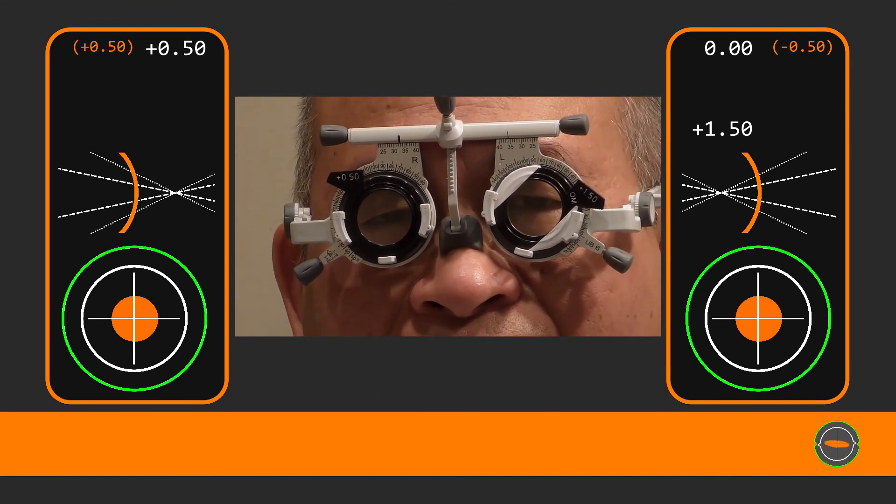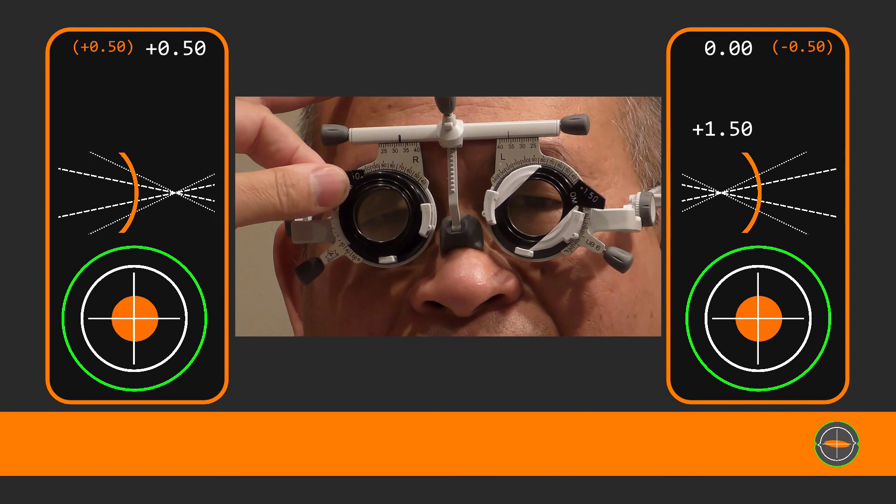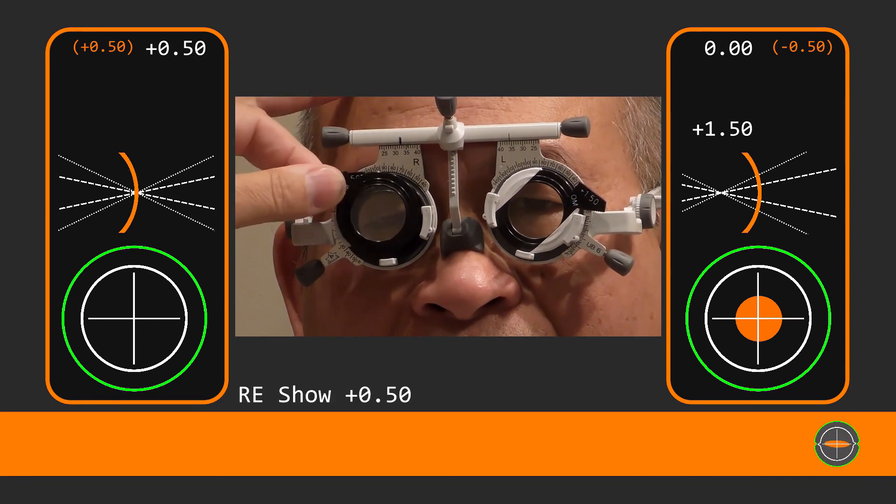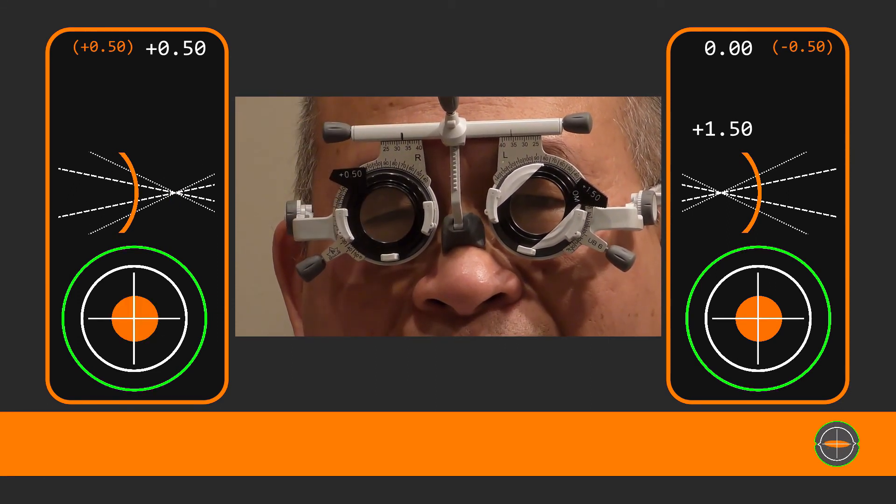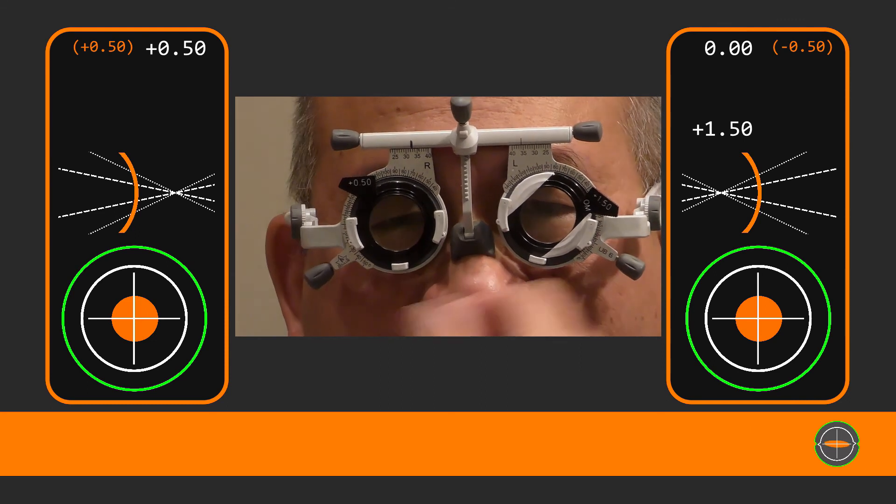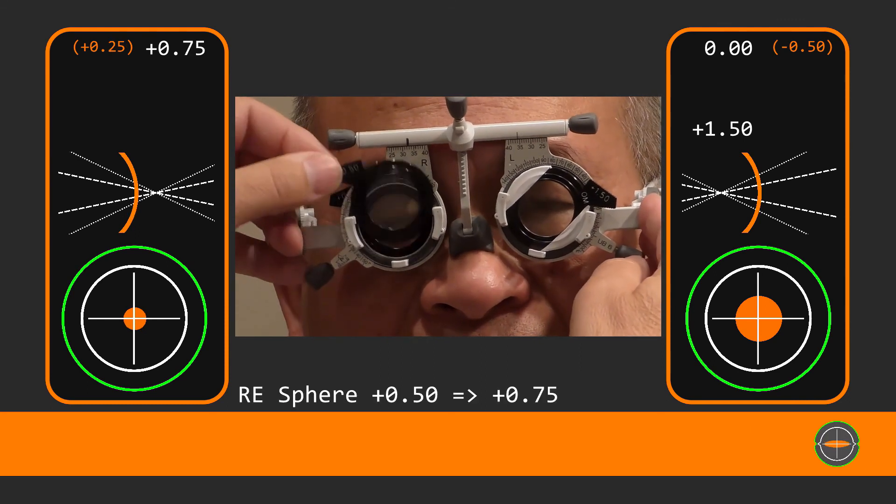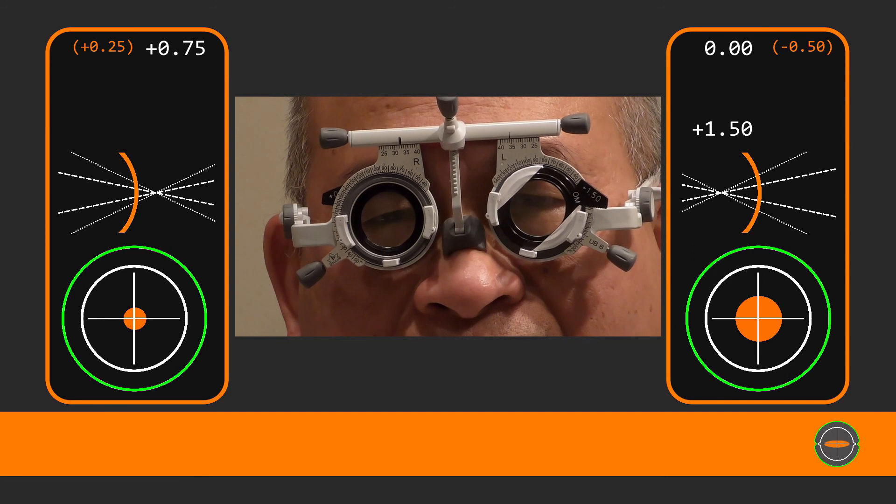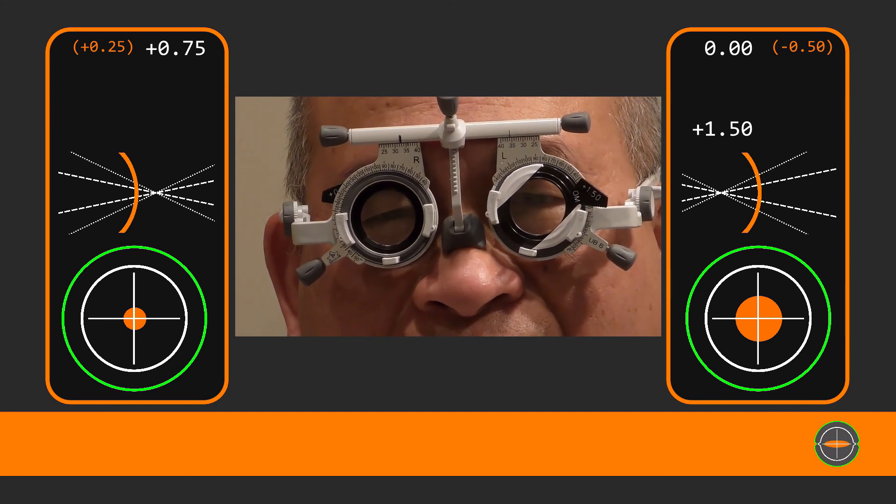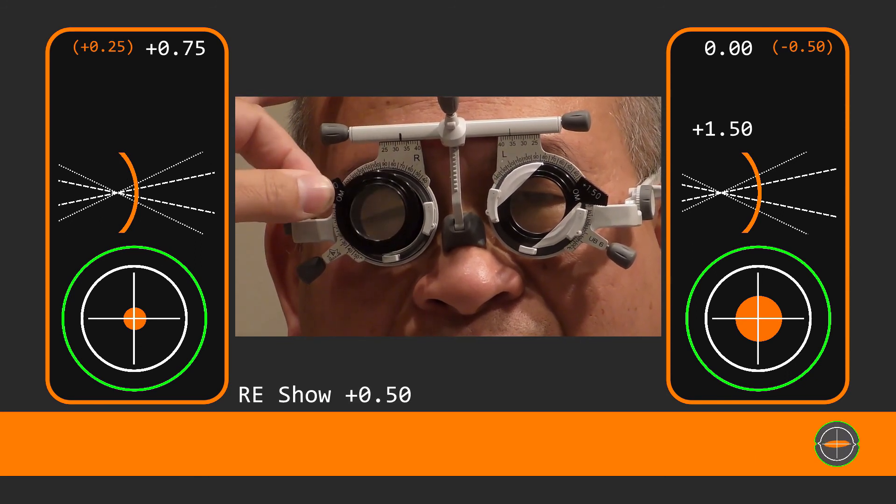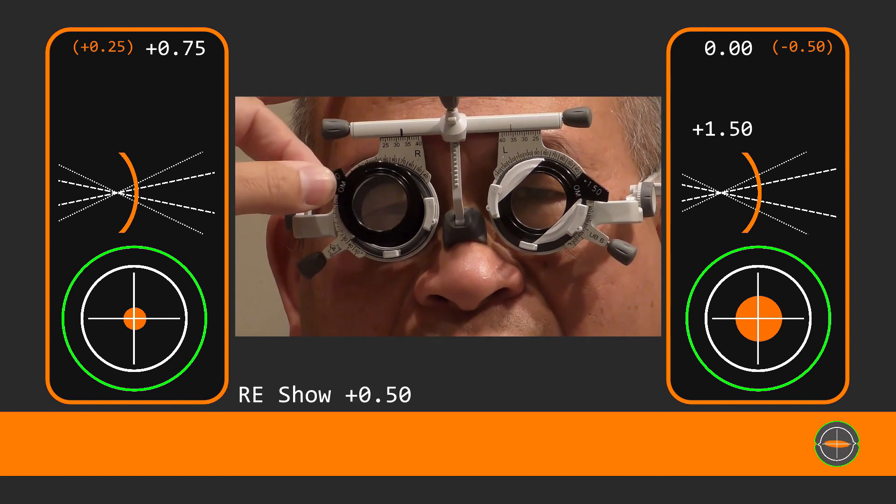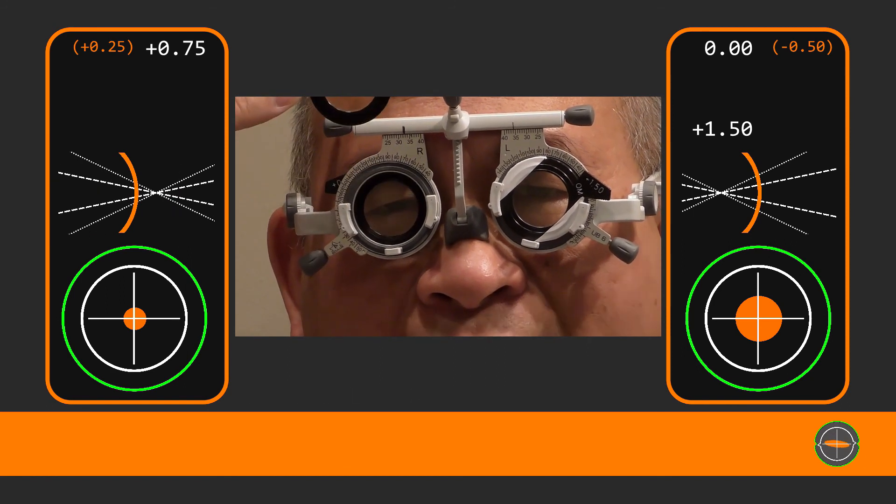Let's continue with the refraction. And better with this one or without. With. That's good. And better with this one or without. Let's try again. With.